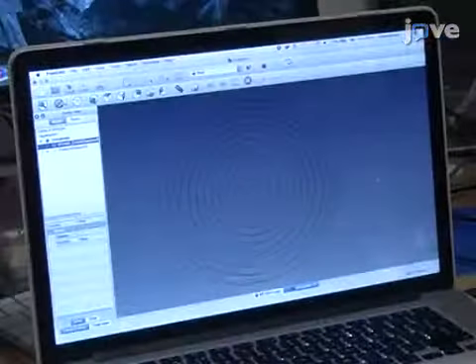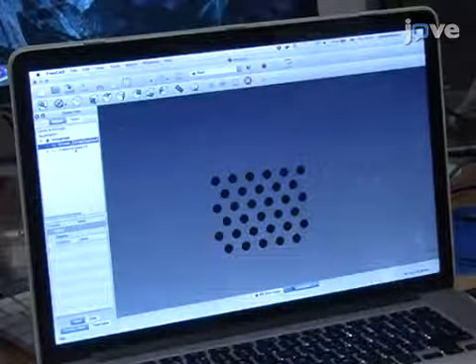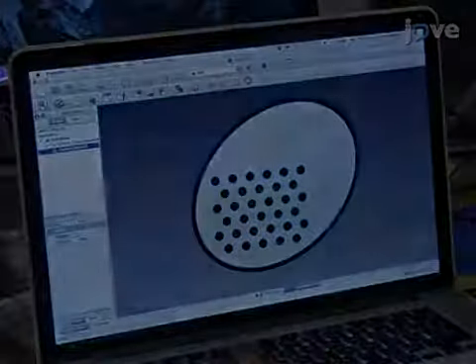For laser patterning of the sample, first design a pattern of asymmetric circles and use the appropriate design software to prepare a drawing exchange format file.